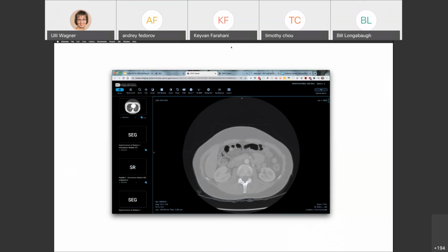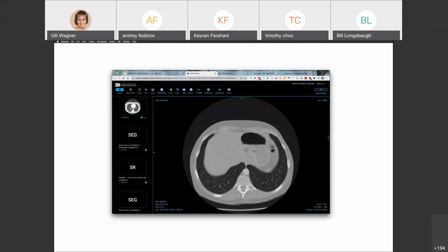Appreciate it. Okay, so I think I know the reason why my voice was breaking up: at the moment I opened this imaging study in the viewer, we are using the zero footprint OHIF viewer as the basis, and every time you open the study, before you can see the image, it has to be downloaded to your computer and into the browser.